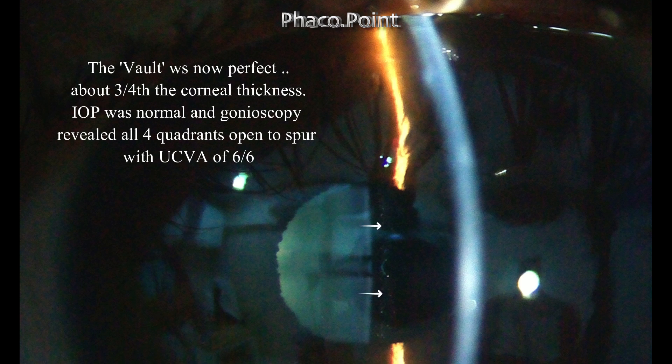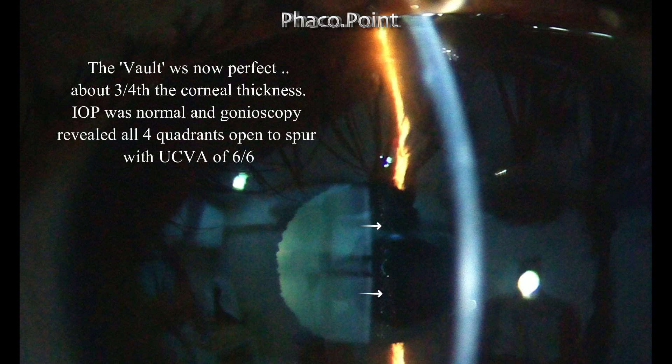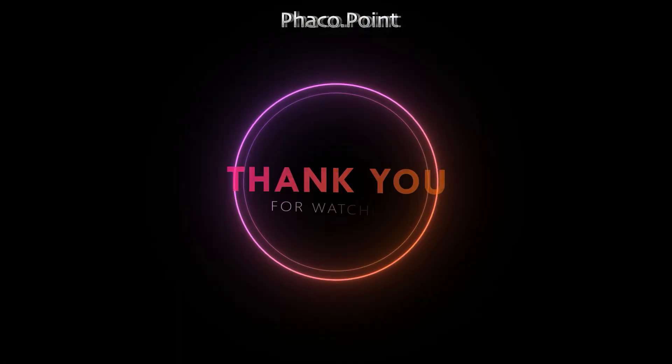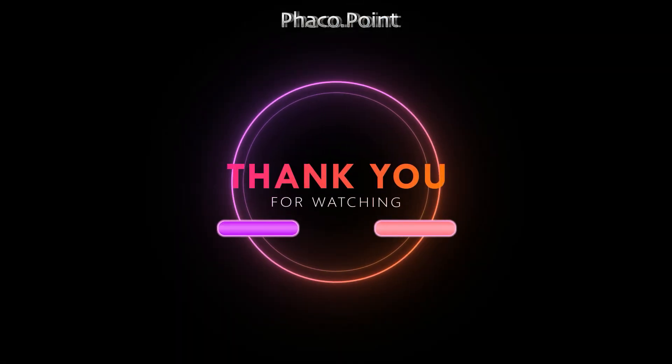In the post-op period, I found that the vault was excellent — almost perfect, about three-fourths the corneal thickness. The IOP was normal and gonioscopy was open to the scleral spur in all four quadrants. The patient had excellent visual acuity in this eye also. Just by changing the direction of implantation, you can actually help to modify the vault of the ICL. Thank you for your attention.